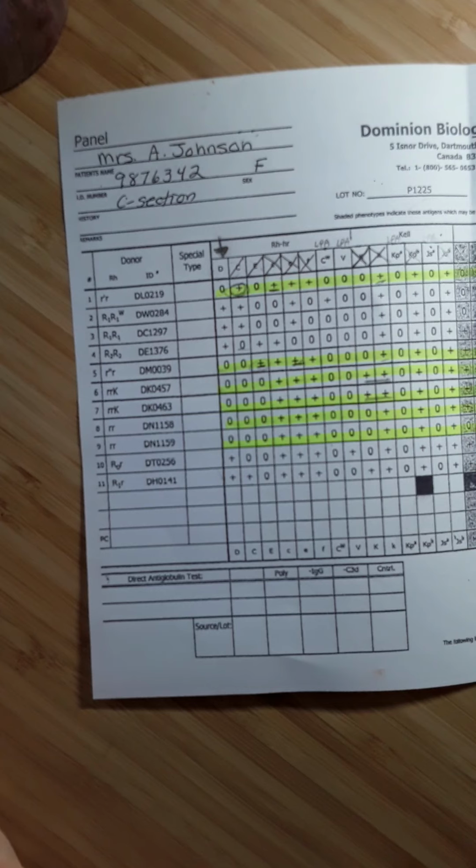We don't need to be starting an IAT cross-match, which takes about 20 minutes, when they call. We want them to call and we have the blood ready. So we will do the IAT cross-match right away on Mrs. Johnson and find 2 D negative units that are IAT cross-matched for her right away. Get those units tagged and get them back on the shelf, and they'll await a phone call from the patient care unit to send up these particular units for Mrs. Johnson. So that's the antibody ID on Mrs. Johnson.